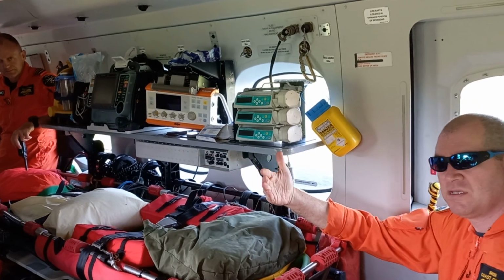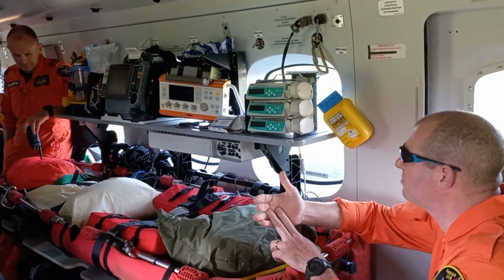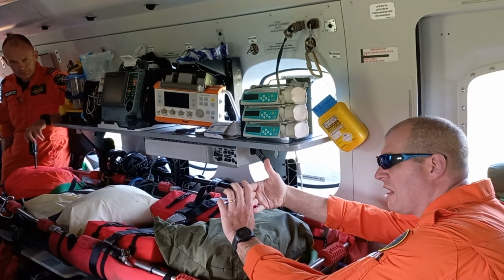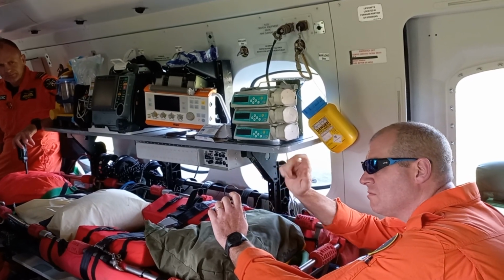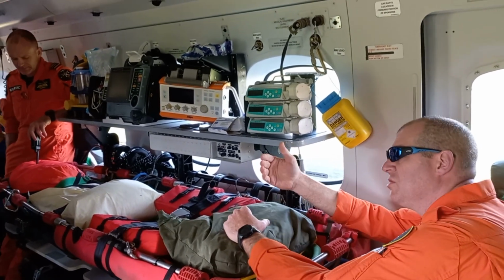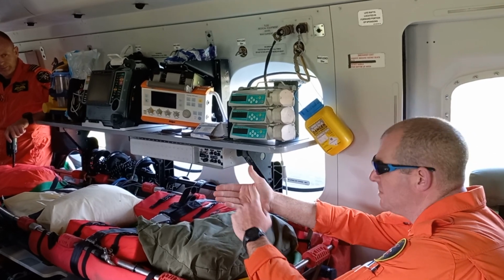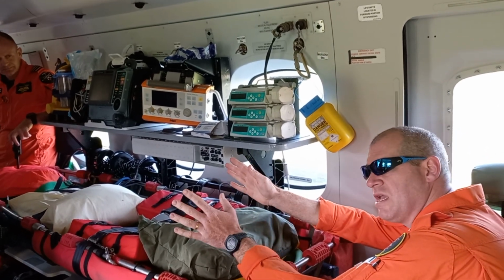With that, it does our defibrillation, it does AED, it does manual defibrillation, it does blood pressure, it does ECGs, and with the ECG, we can recognise if a person is having a STEMI, or a heart attack. I know on Sligo's machine, we can basically fax that. Yeah, it emails it to the cardiac reg in Galway, or the cardiac reg up in the Derry hospital. He gets it on his iPhone, opens it up and goes, yep, that guy's having a STEMI. And we'll make contact, tell him we're 20 minutes or an hour, whatever it is, and we bypass A&E and we go straight up.